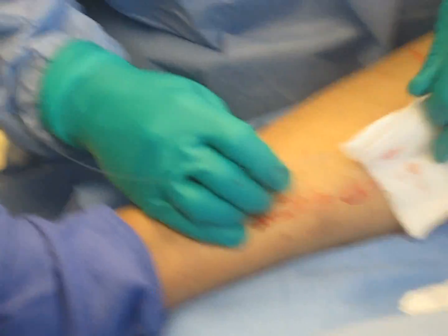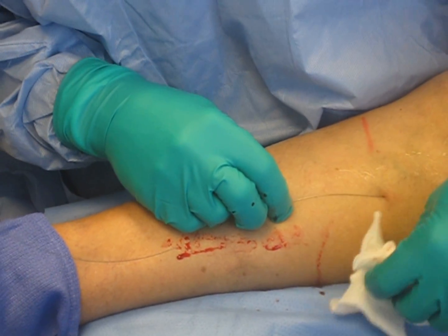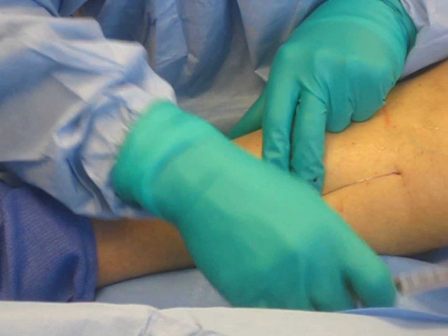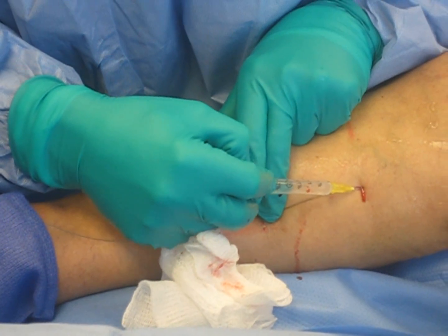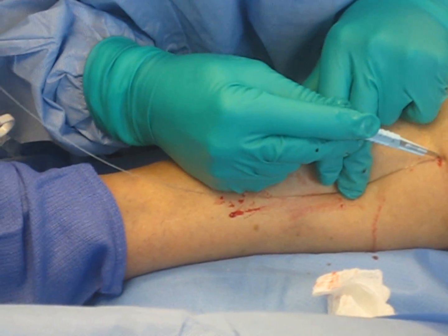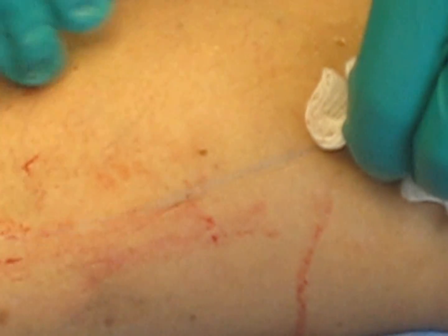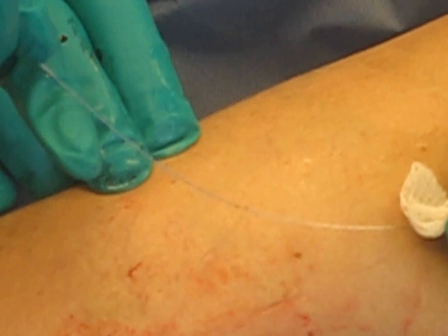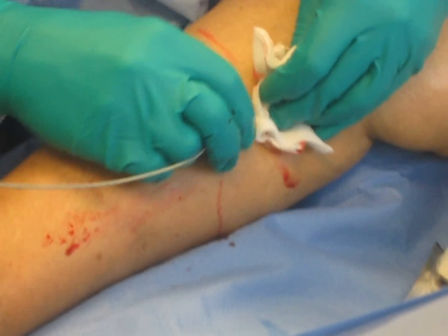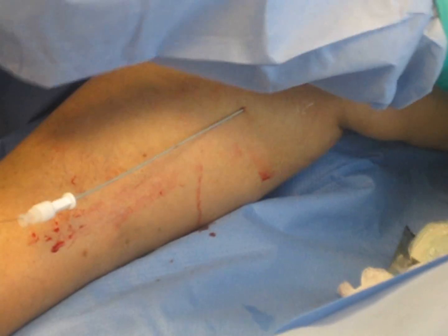Our next step is to take our access needle off this guide wire. Then I'm going to numb up her skin a little bit more and do a little tiny skin nick right here. You let patients know — they're pretty surprised how little discomfort there is. Nancy's bringing this little catheter over the guide wire. There's a little tiny pop right here. Her veins are real tender, but this is the typical scenario for patients.